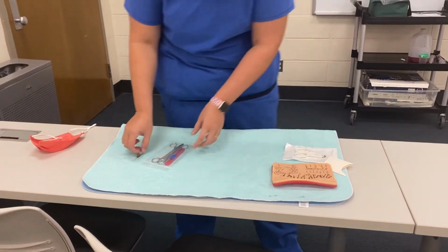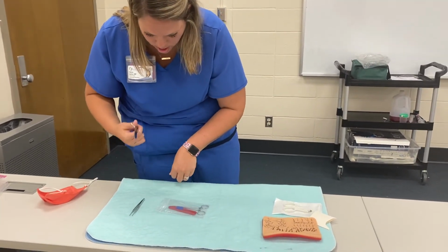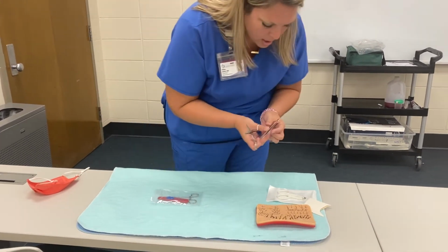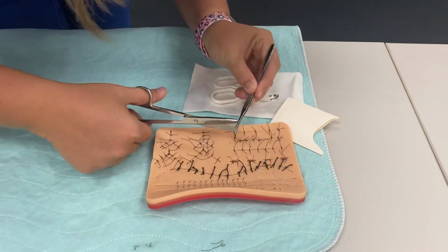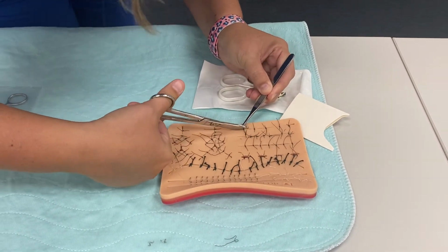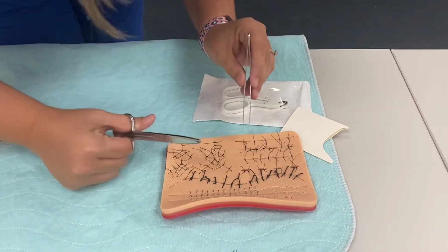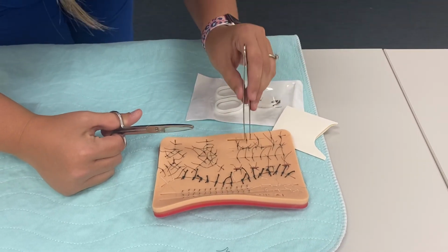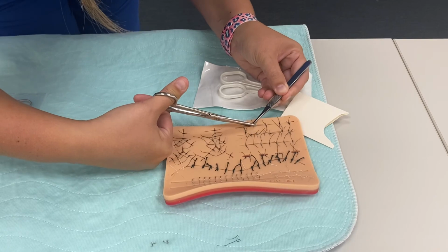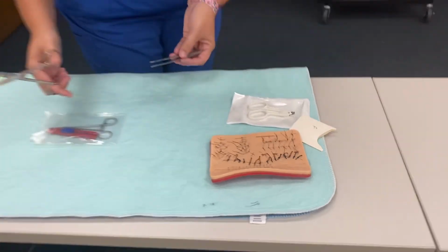For the suture removal, I have a pair of tweezers and scissors. All I do, we're going to see if they have a good suture for us to remove, is pick it up with the tweezers, go under the suture, clip it, and pull it out with my tweezers. I just want to make sure I get that full suture and keep count of it. Again, I'm just pulling up my knot, sticking my scissors under it, and pulling out my suture. Y'all will get hands-on practice with that in your stations this week.